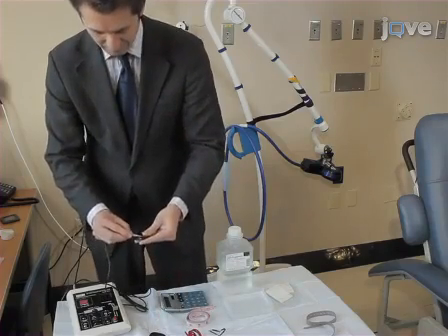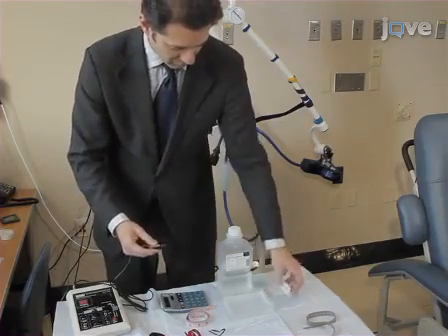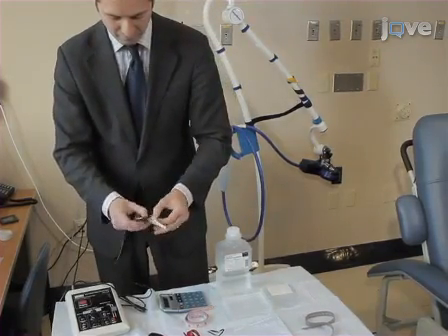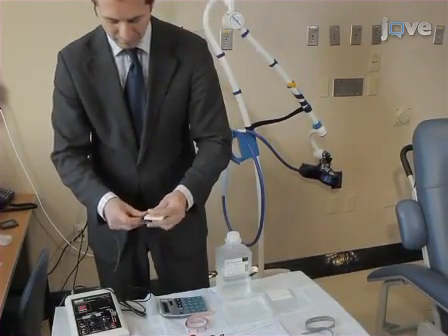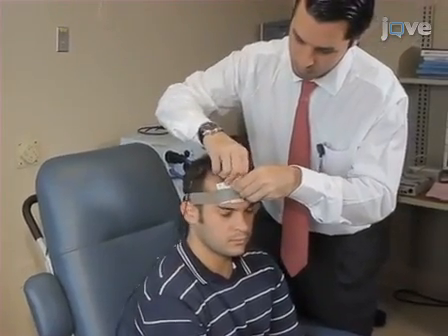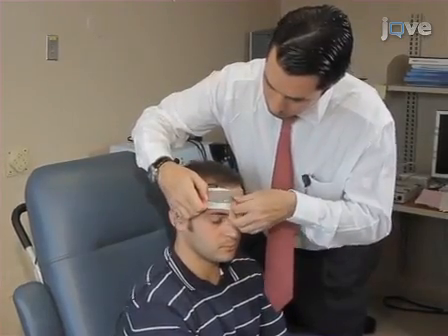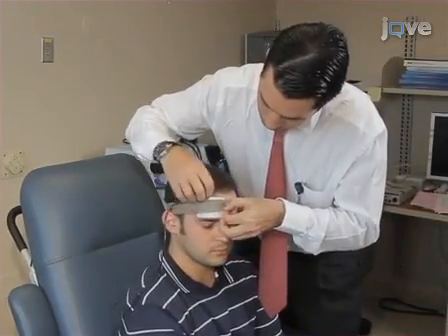Now, insert the connector cord pin for each electrode securely into the opening on the rubber inset. Then slide the rubber insets fully into the sponge pads, being sure to place the anode and cathode in the correct locations. Now, place the sponge pocket to hold the cathodal electrode underneath the elastic head strap. Here, the sponge is placed over the supraorbital region.